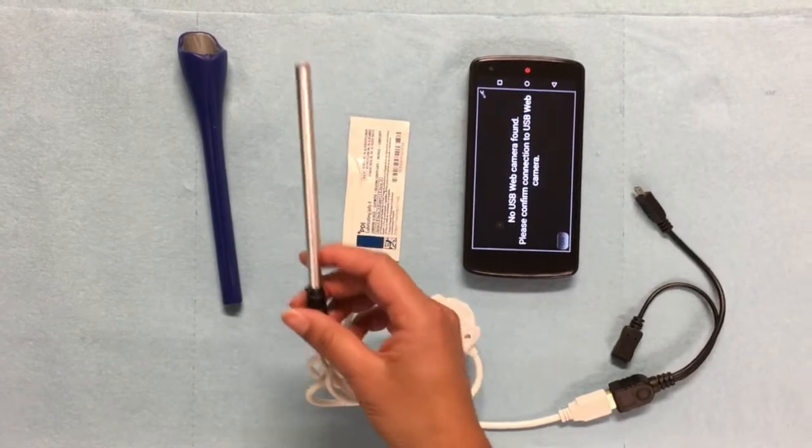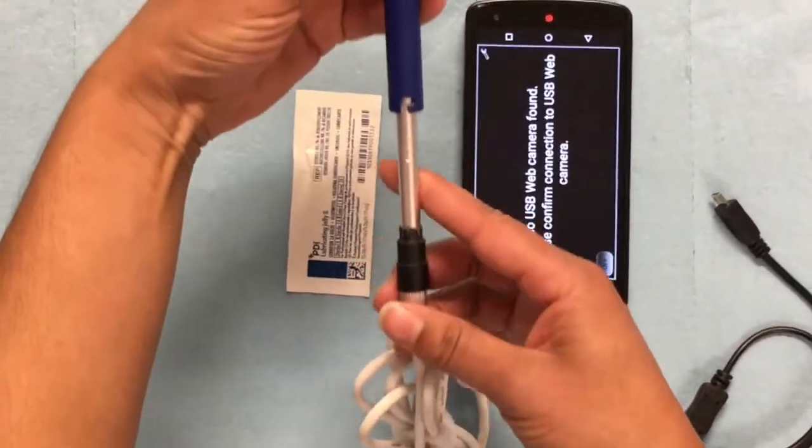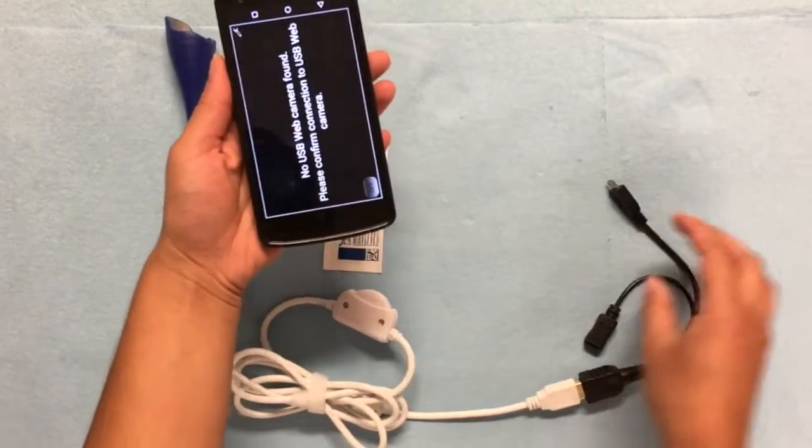You will insert the camera into the bottom of the Kala. Next, twist the bayonet to lock the camera in place. Then, connect the phone to the camera using a USB connector.